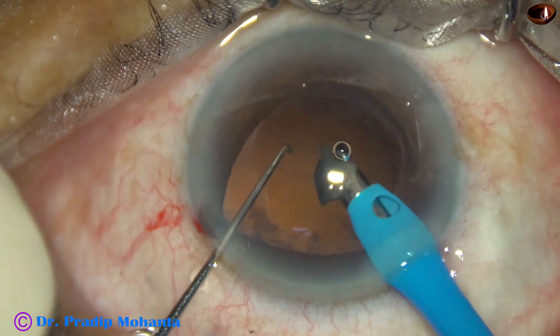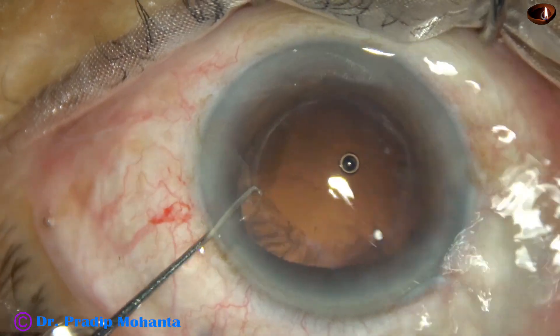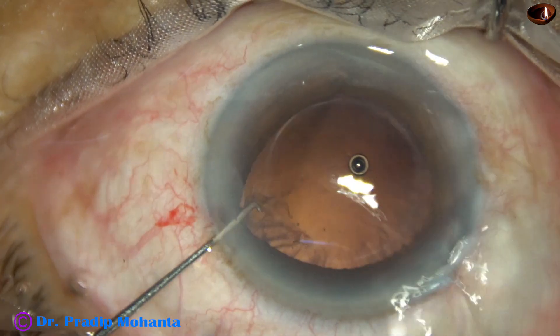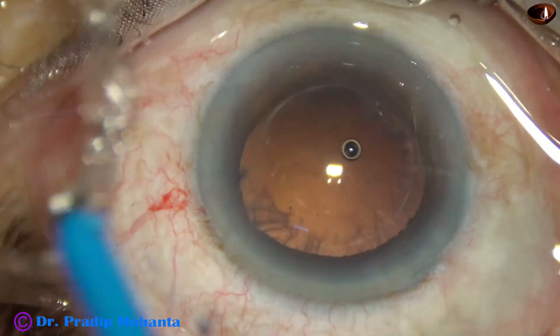Now see — after emulsifying this, I am removing the handpiece first and then the side port. Watch it again: remove the handpiece first, press on the iris, let the iris fall back, and then remove the chopper.